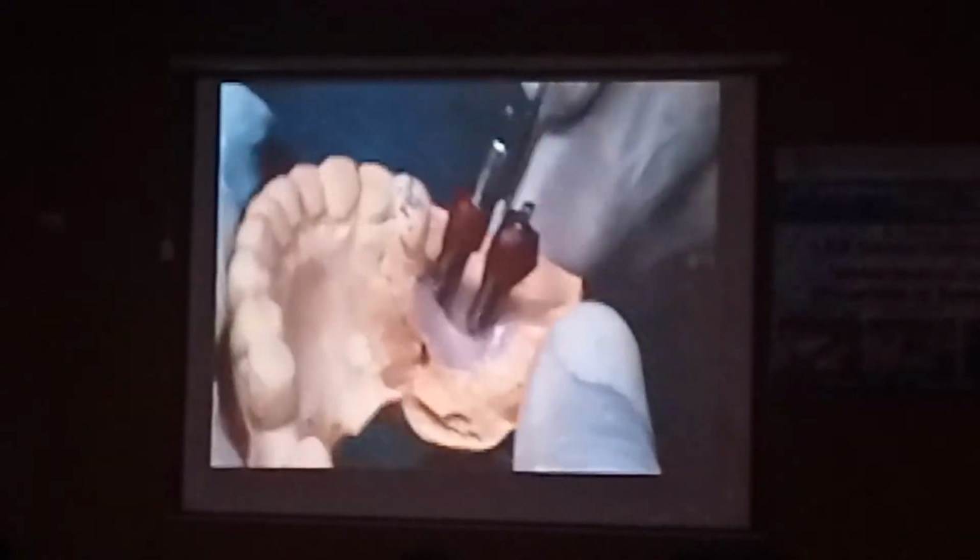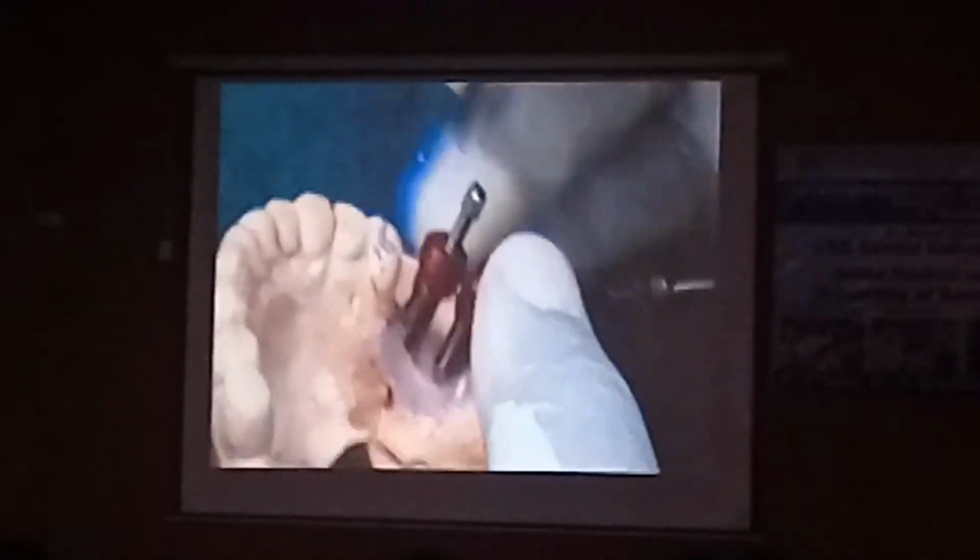But now because you are only rebuilding this part and not the complete part, the chances of error are much reduced. Even if these two things would have been so far apart, the gap that you have to fill is only this much of a gap.